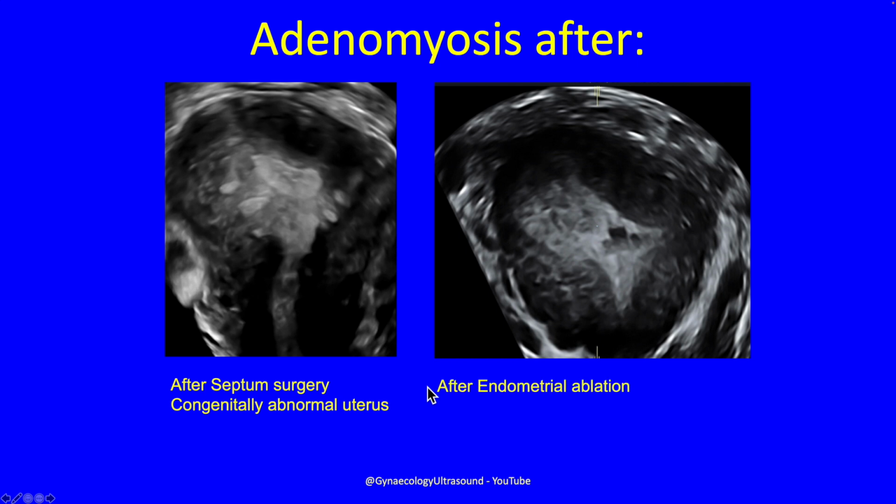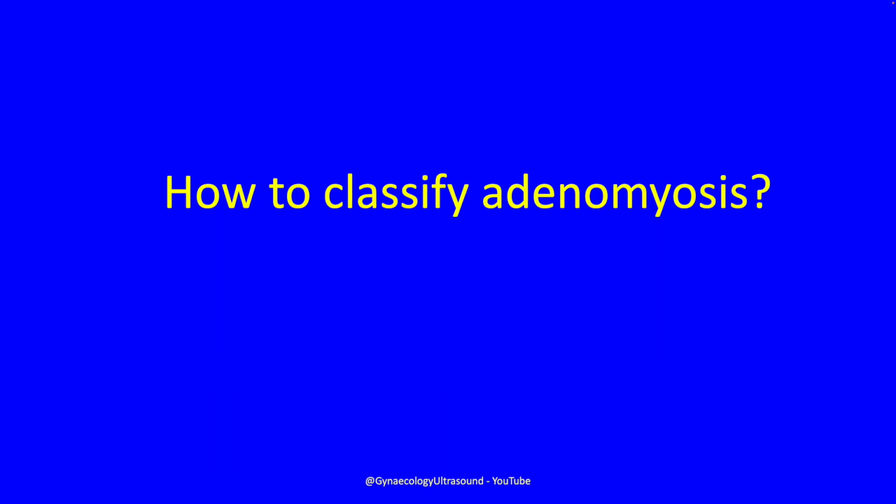And in this case, where a person had endometrial ablation, you can see that this is the original cavity, and this is where the ablation has happened. You've got myometrial adhesions, so no endometrium, and the endometrium seems to have grown into the myometrium just there, so the patient will have continued with her symptoms. Again, this is suggestive of retrograde menstruation causing these problems.